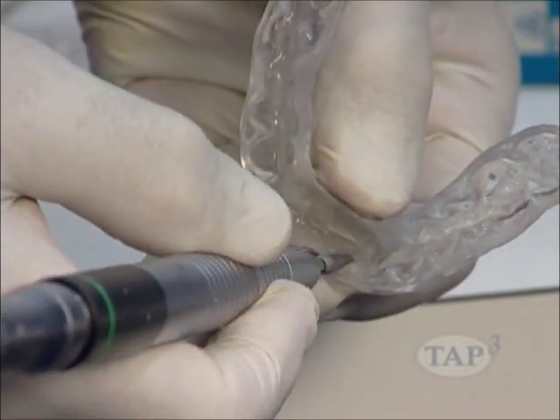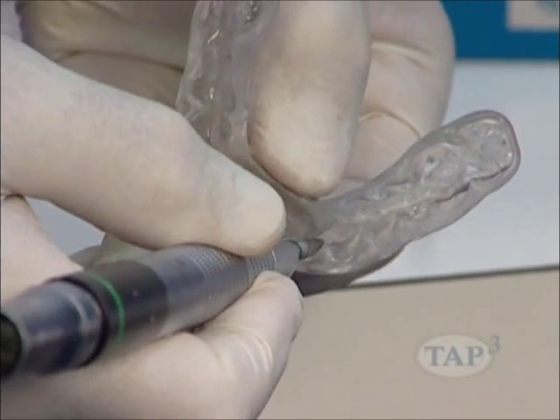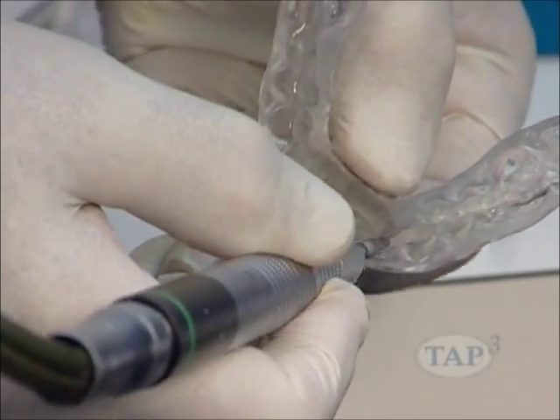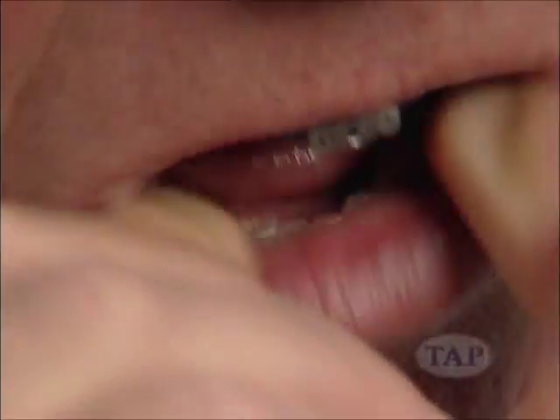Be conservative with your adjustments. They should be very slight. Any over-adjustment may affect the retention of the trays. Fit the tray in the patient's mouth with each adjustment to avoid over-adjustment. Have the patient remove the upper tray from their mouth. They should remove the tray by starting from one side on the posterior and pulling down.